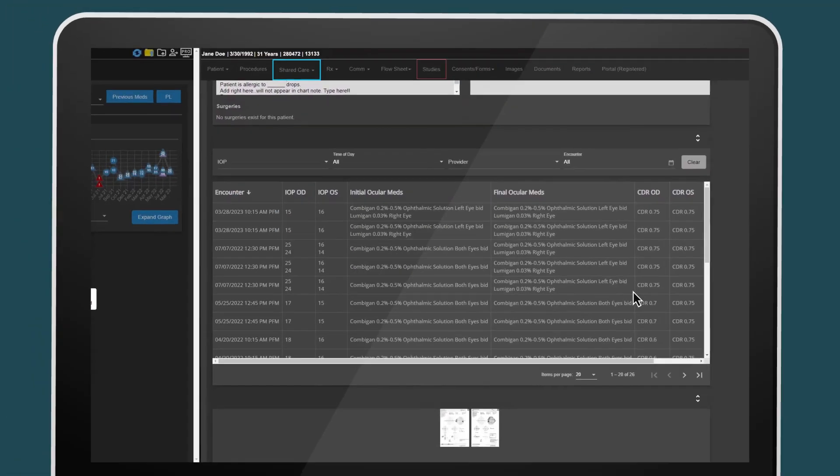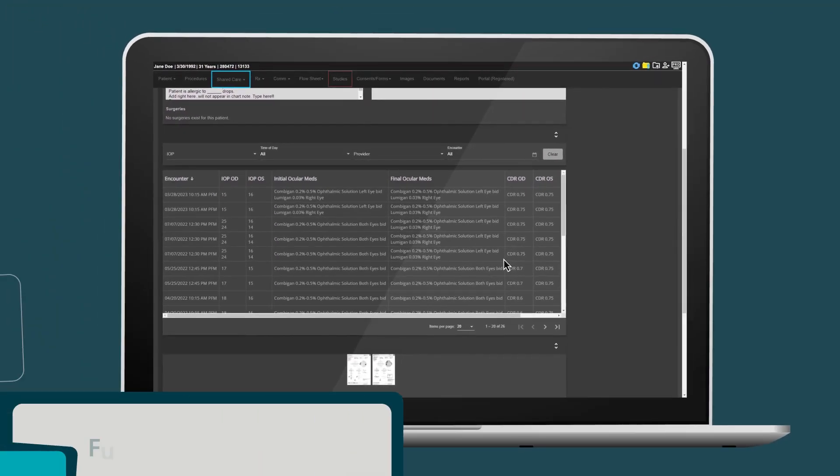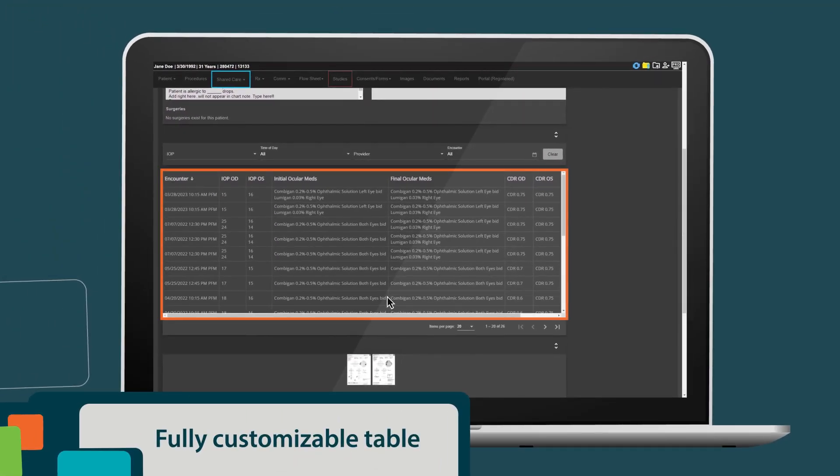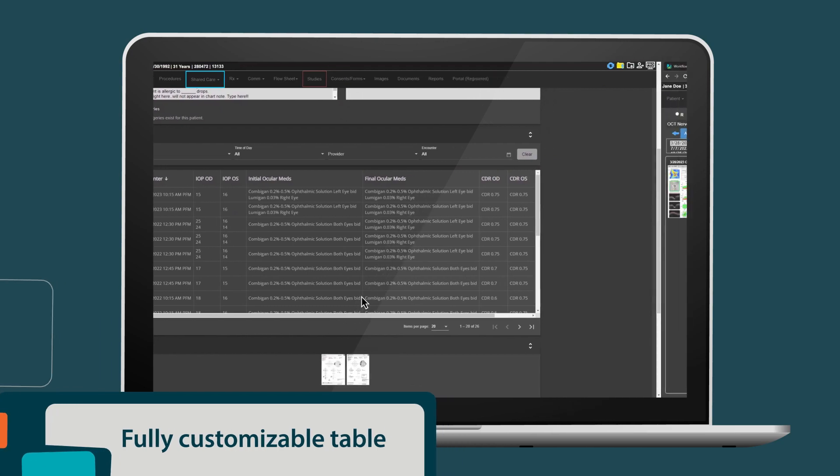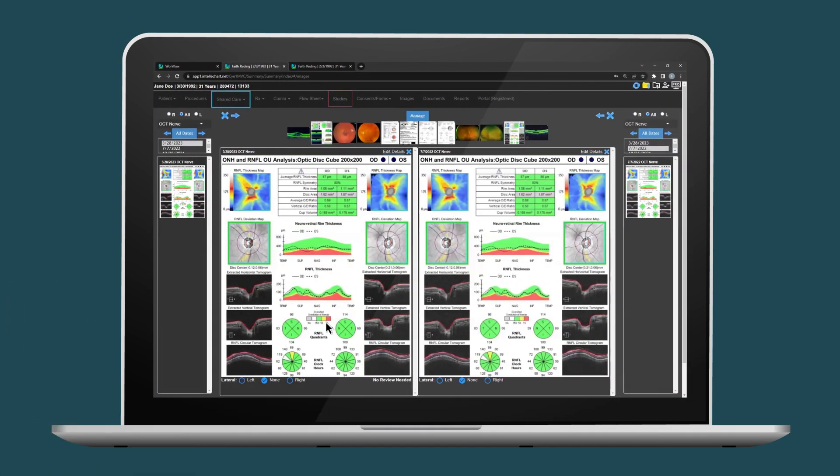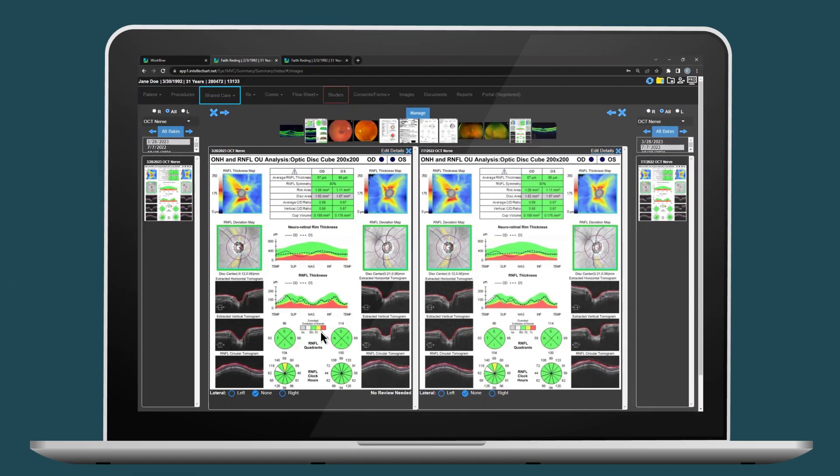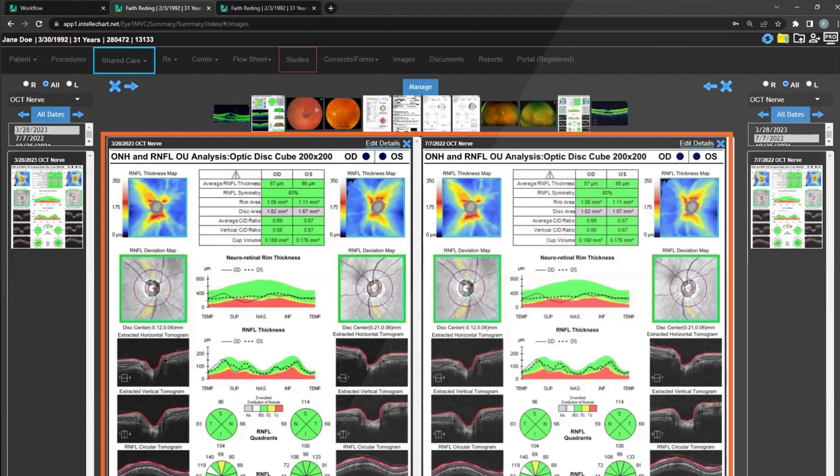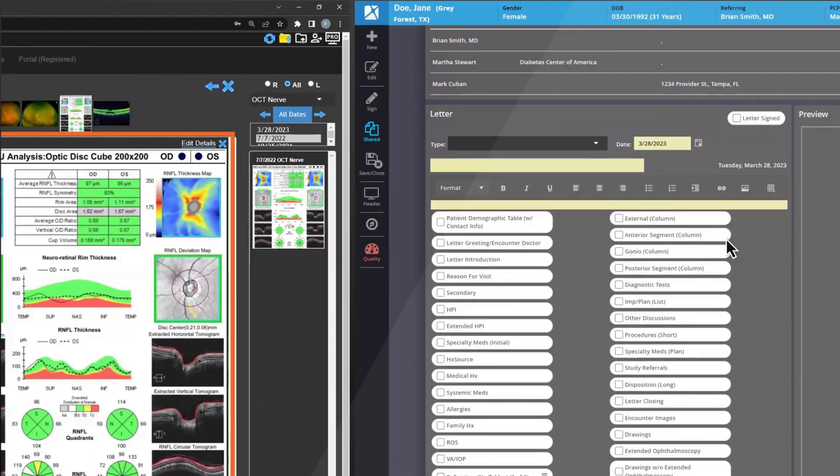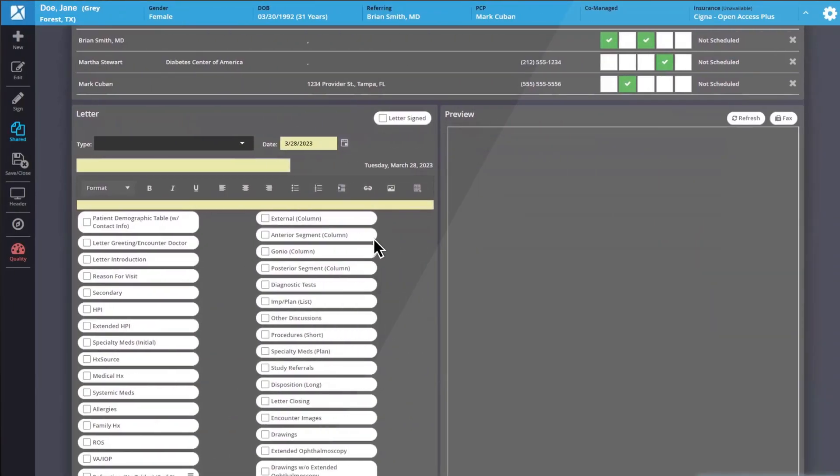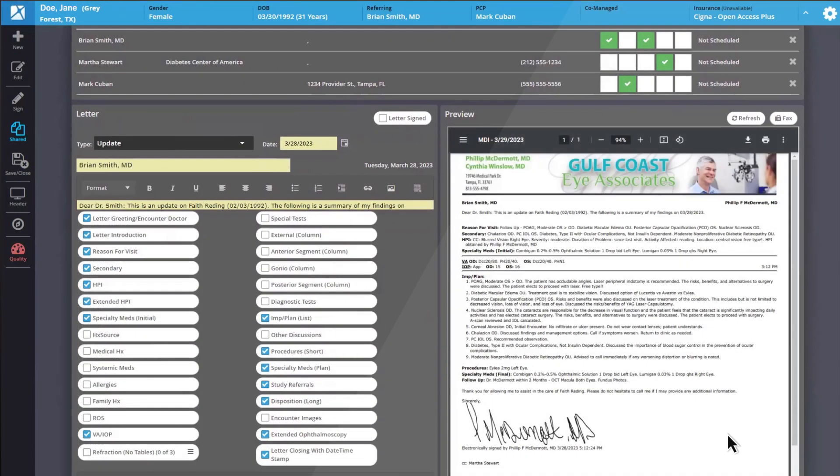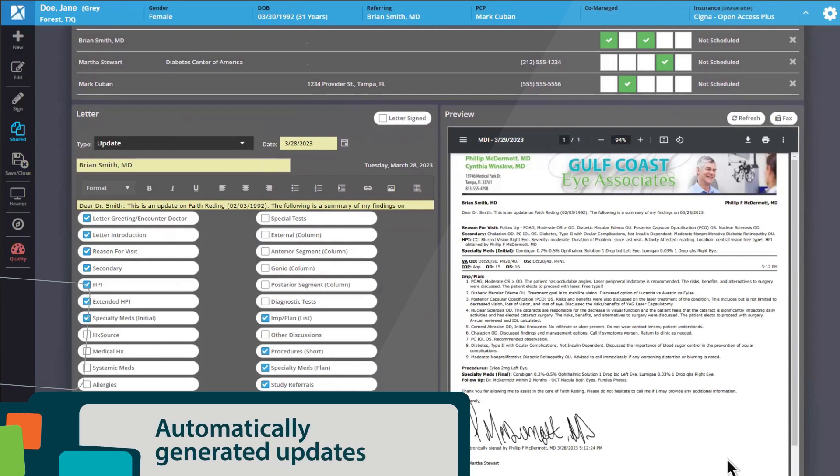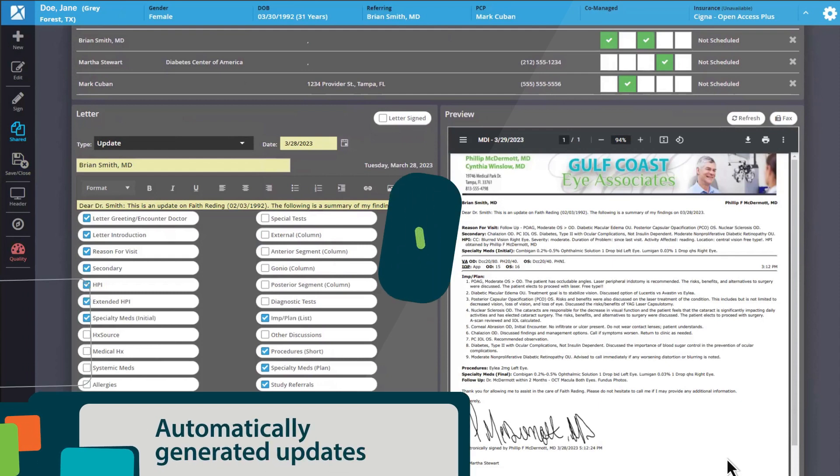Save time with a customizable table that displays key data elements. Pull up data and results instantly, including side-by-side image comparisons, and easily share pertinent HIPAA-compliant patient information with automatically generated updates and letters between eye care providers.